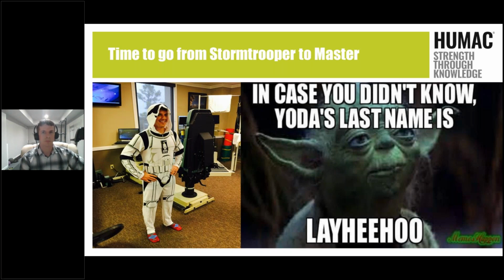The first thing I'm going to look at is just 25% of their effort, and I want to equate what force measurement they're giving us, just like you taught us to. So I can figure out what 25% of their effort is, and then I can manipulate back and forth from that standpoint to make it appropriate for that patient.